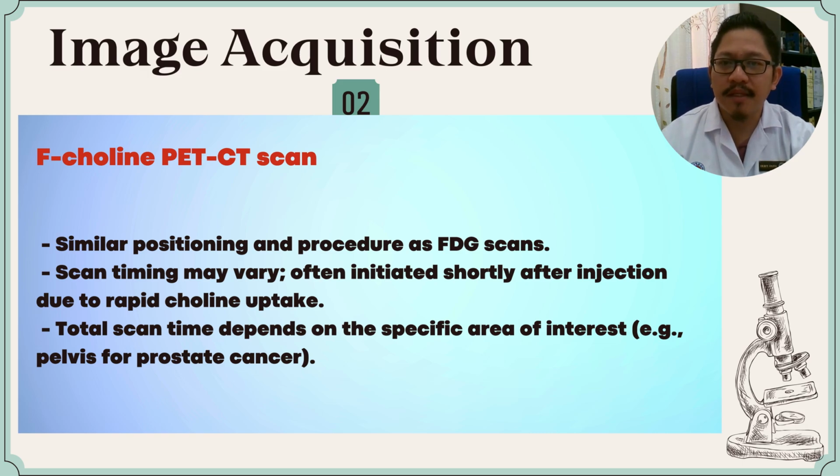18F choline PET CT scan has similar positioning and procedure to the FDG scan. The scanning time may vary, often initiated shortly after injection due to rapid choline uptake, and the total scan time depends on the specific area of interest, for example, the pelvis for prostate cancer.